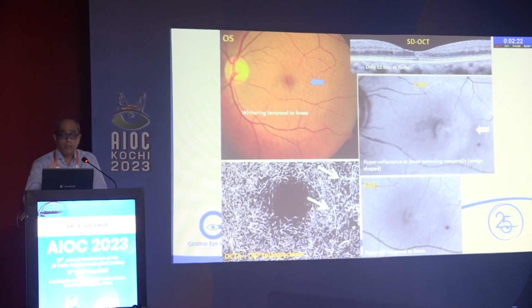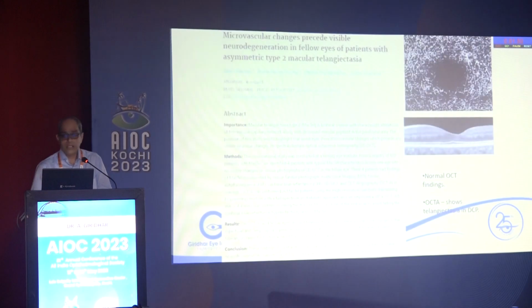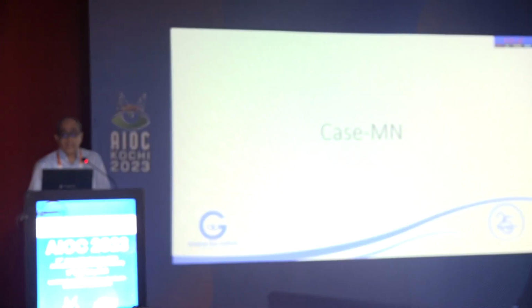Solar retinopathy. But using multimodal imaging, you can diagnose MacTel in the other eye: focal ellipsoid loss, increased parafoveal autofluorescence, very important to diagnose early MacTel. You understand? Early MacTel. Therefore, although the photograph looks normal, on careful OCT there is a small defect, and in autofluorescence you can see this increased autofluorescence. Using multimodal imaging, early cases of MacTel you will not miss. You understand? So, this is my last case.